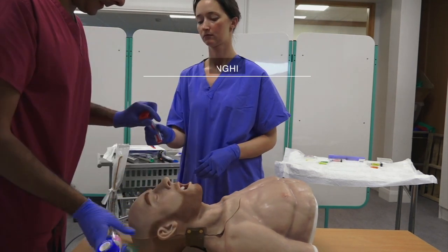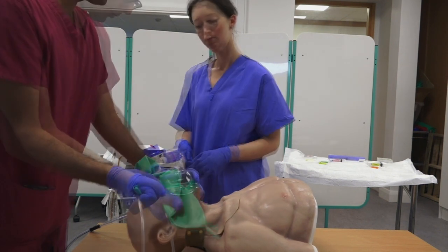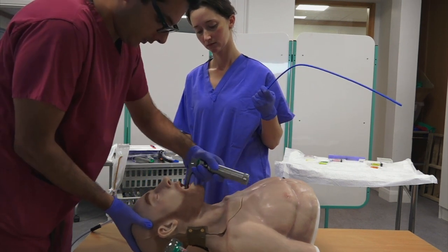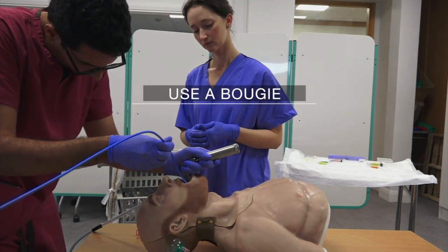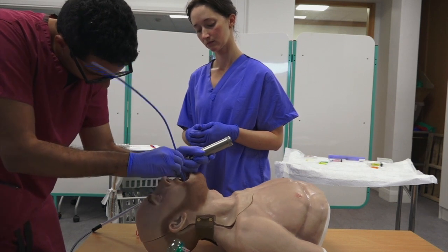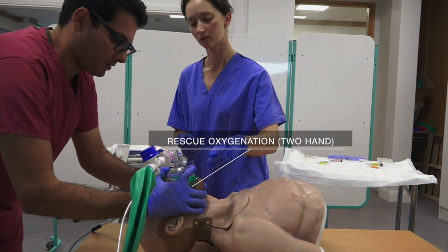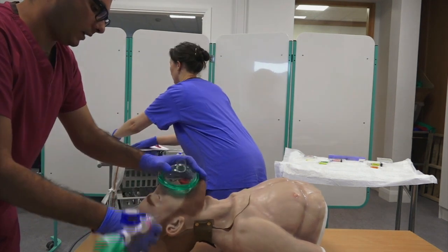Face mask ventilation is proving difficult, so an oropharyngeal airway is inserted. The second intubation attempt is now performed using a bougie as an adjunct. Difficulty is encountered inserting the bougie, so this intubation attempt is abandoned. Face mask ventilation continues to be challenging, so a two-hand technique is used. A nasopharyngeal airway may also be inserted to improve face mask ventilation.